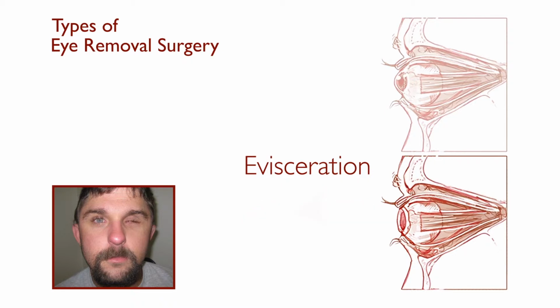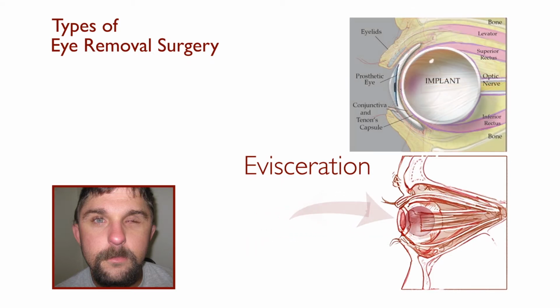To replace the size and weight of the contents, a ball-shaped plastic implant is placed inside the scleral sac. The selected size is as large as possible, allowing for closure over the front. The white sclera forms a tough covering to the implant, which is placed inside before the sclera is sewn tight, and it moves almost as well as before, moving with the other unaffected eye.